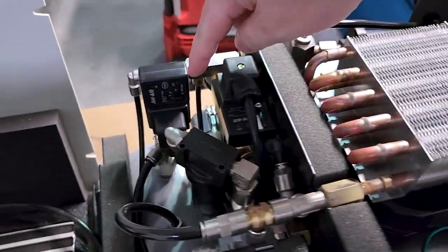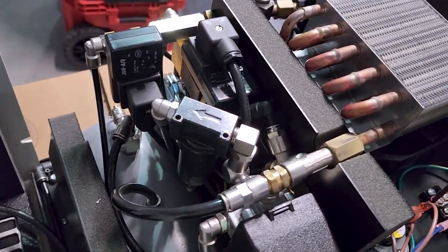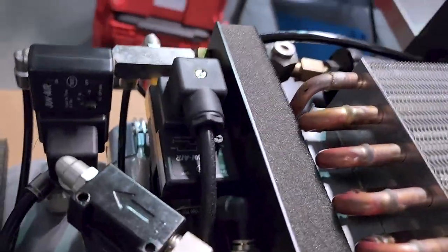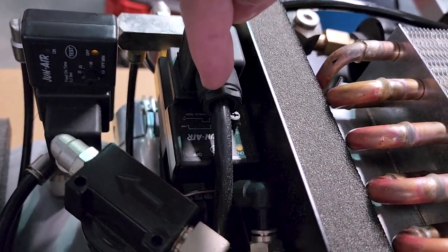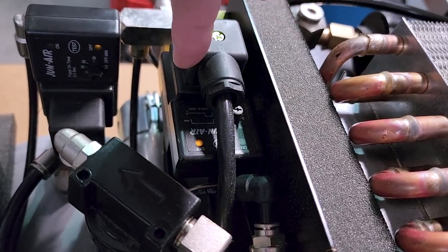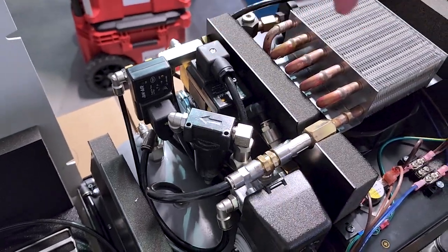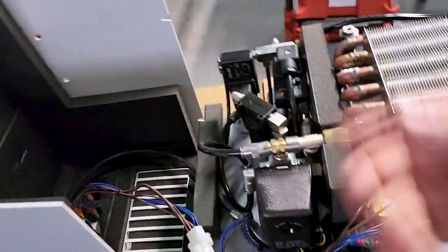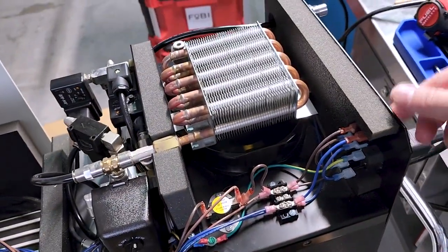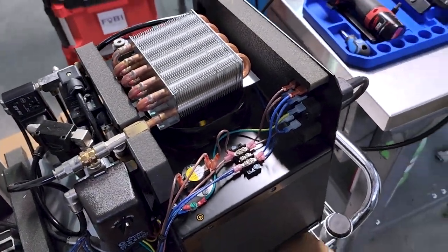So I'm going to open it up so you guys can take a look at these guys right here, and you can see how they function when it's running the cycle. They only last about 5 seconds, and then they switch their state, right? Here we go. You can see it's in the off condition right here. And then you see this one here is in the on condition, and it just switched. Ta-da! There you go. So that's it purging. Notice, even with the cover off, it's super quiet. There's a lot of noise dampening, even in there. The company, Jun-Air, took a lot of extra conditions to make sure it's as quiet as possible. So that is a normal system.